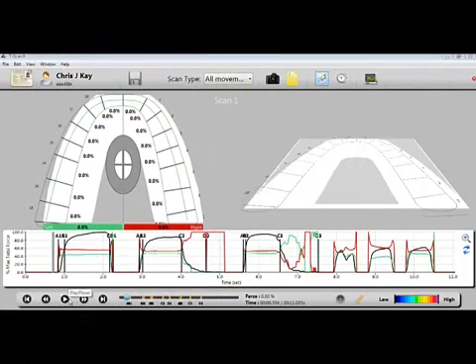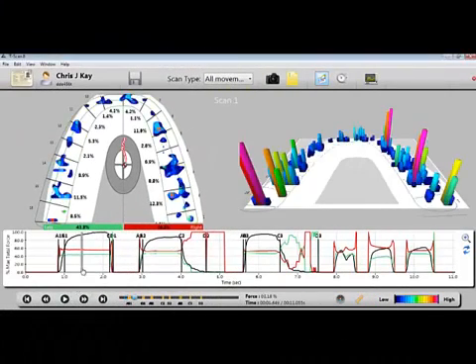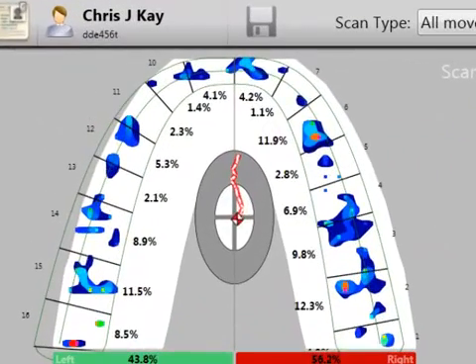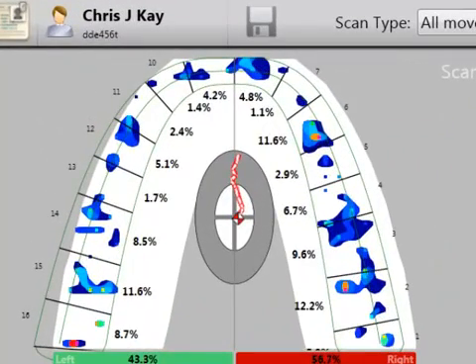Center of Force, or COF, illustrates the balance of occlusal forces acting on the teeth as the patient bites on the sensor.